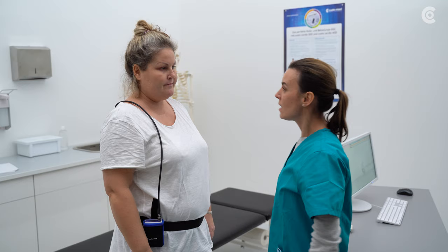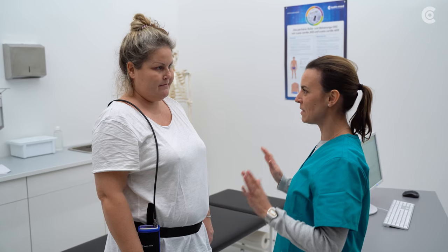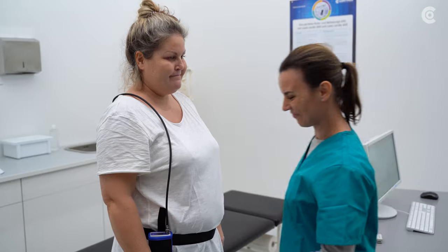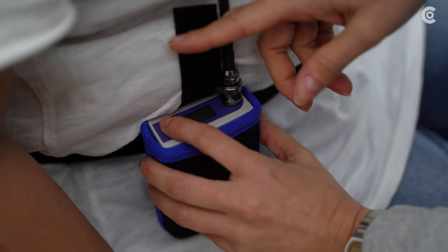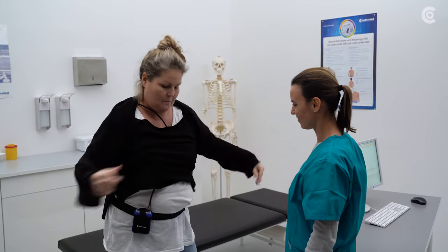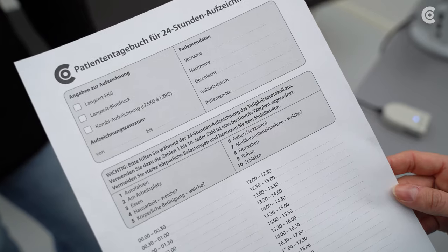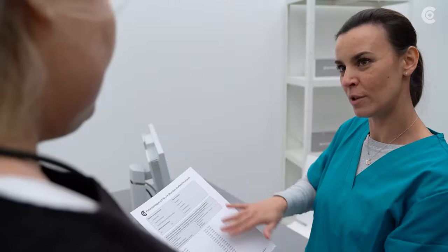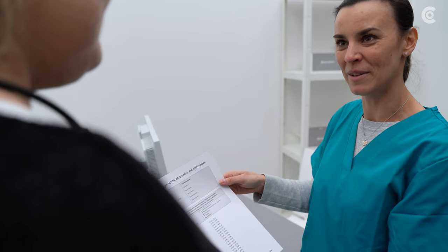Now carry out a test measurement. It is important that the patient keep still. If the measurement fails, improve the position of the cuff and tube. If the test measurement has been successful, the recorder will be ready for recording and the long-term measurement will start automatically. Now you can explain the patient diary to the patient — keeping it correctly is helpful for later evaluation.